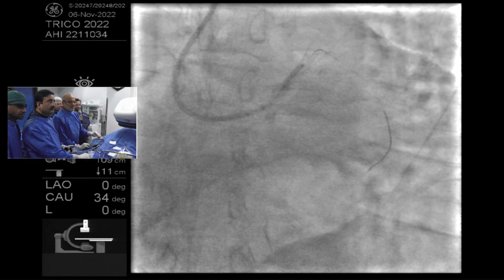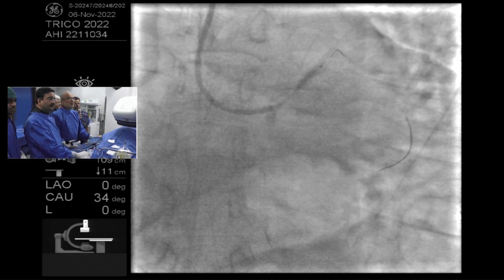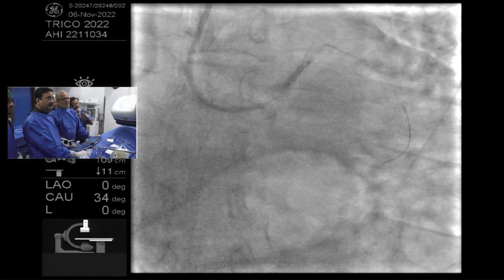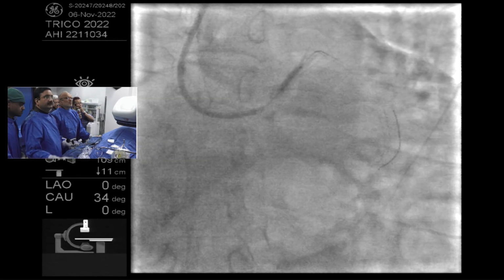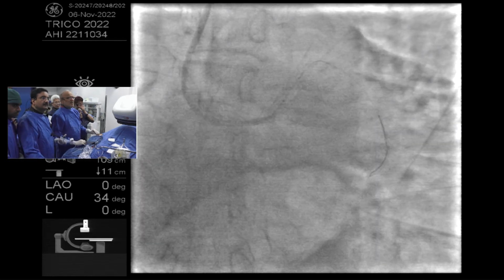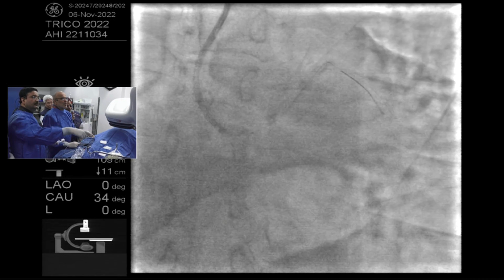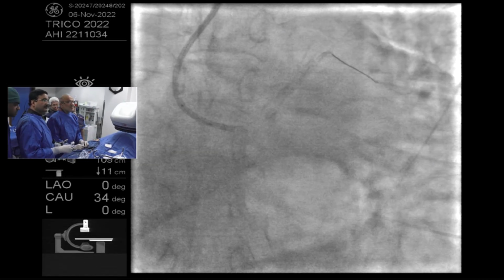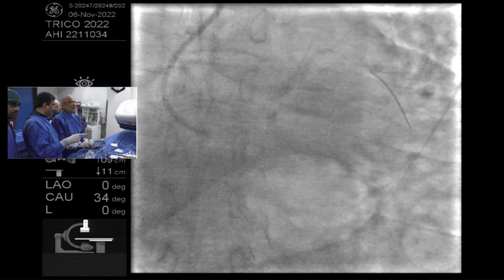One more question is the sizing of the IVL balloon. So many times there's a taper, so it's not 1:1 in the arteries. You have a real step down. So how would you size? Would you go 1:1 for the proximal or for the distal? Many times more than one artery is involved, so that also becomes an issue. So you have to go with distal, but then if there is a 0.5 or bigger difference, we take a second balloon. That becomes very costly. That's the issue. And with the distal diameter, 1:1 we usually choose.